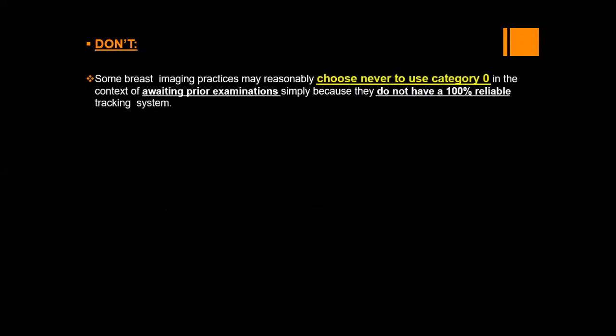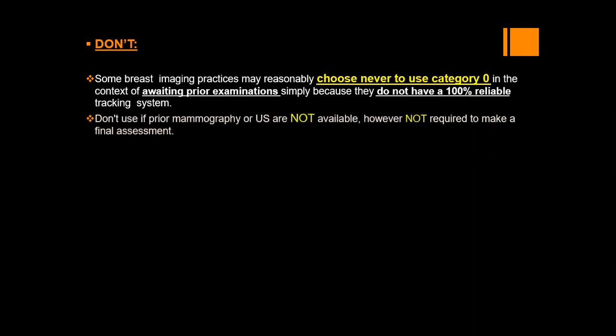When we should not use BIRADS 0. Some breast imaging practitioners may reasonably choose never to use category 0 if they are not sure the prior images will be available within these 30 days. They have no guarantee that they can achieve it.